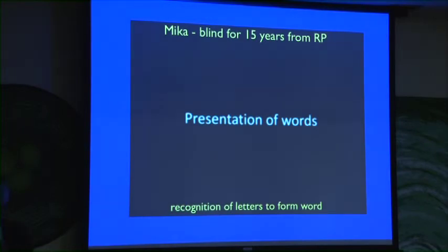Now this is one of the first patients who received one of these implants. He's been blind with no light perception for about 15 years. I have several videos of different things that he's doing, but he's only been allowed to have this implant for 4 months because in the original trials they had to remove the implants after they were placed to look if there was any damage, either to the implant or to the retina.